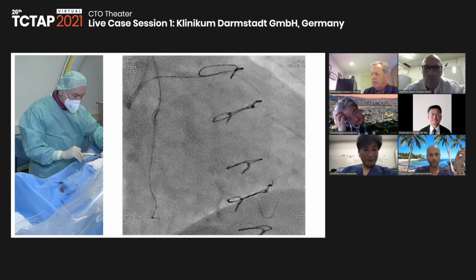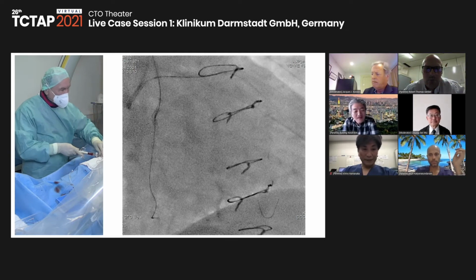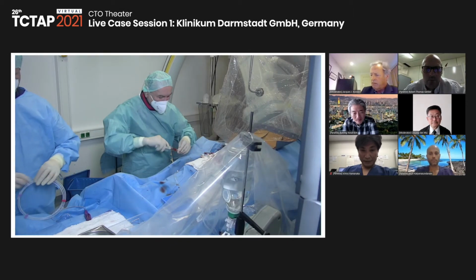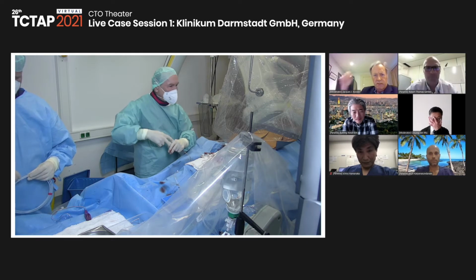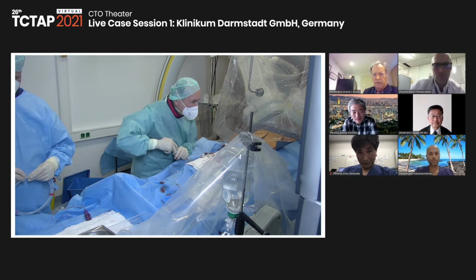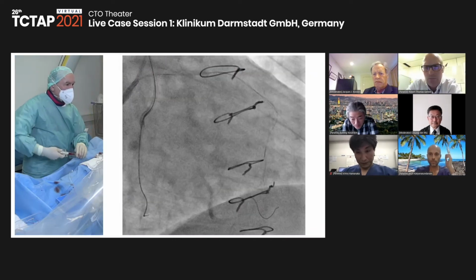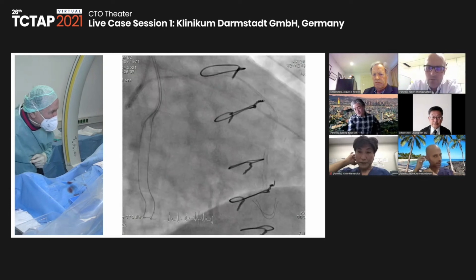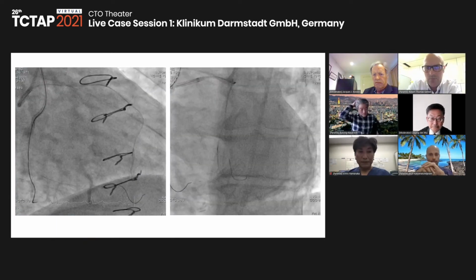Even here, Suo is the top seller, but in septals sometimes it's... You cannot damage the septal, but here I cannot get ahead, so I try to do another injection. Yeah, and try the Suo. It's more risky to damage the collateral with the Sion than with the Suo.